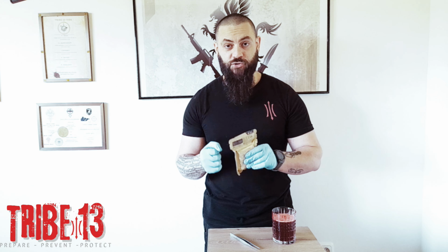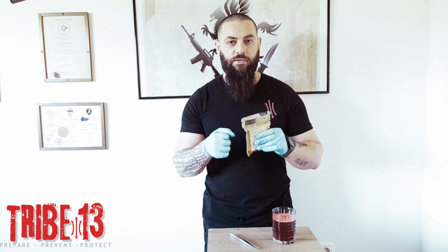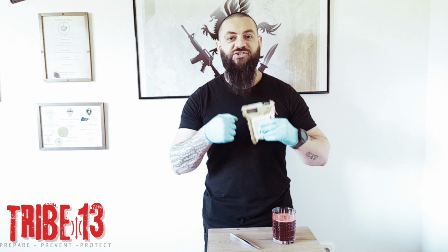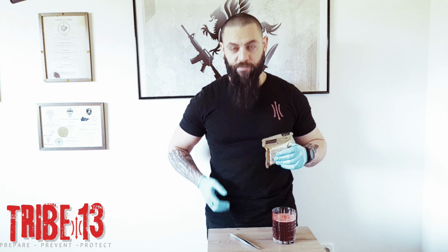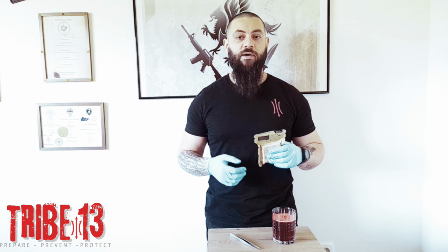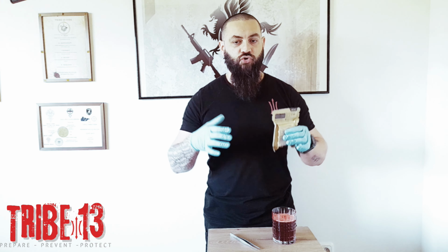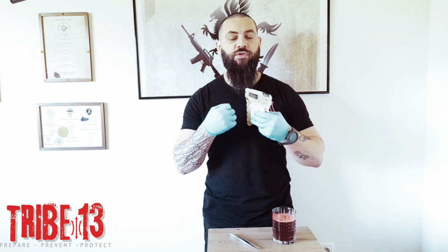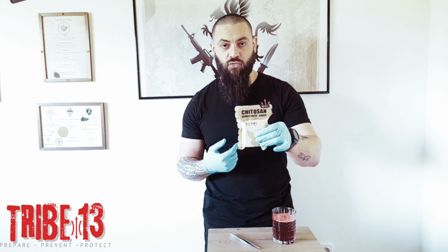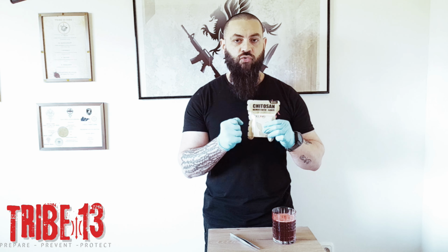But there are situations where, for example, your injury, the massive bleeding, is in a junctional area. This means armpits, inguinal area, like femoral triangle, subclavian, and so on. So in junctional areas, we cannot apply a tourniquet. So there, we are using normal gauze or hemostatic gauze to make a wound packing and control the bleeding.